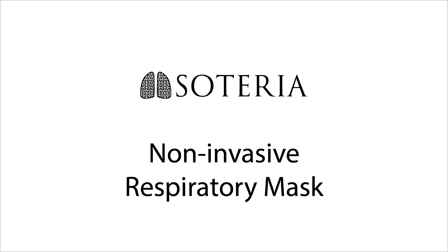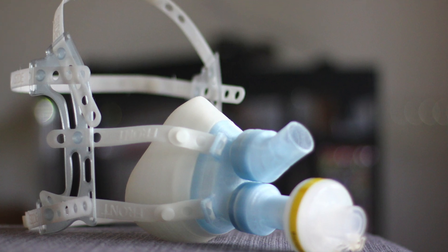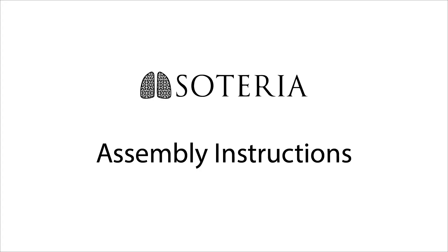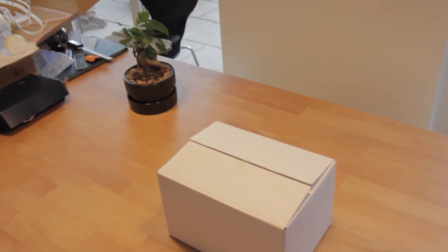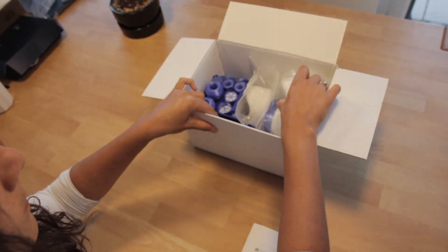Welcome! We are Soteria, a 3D printable, non-invasive respiratory face mask, and this video will show you how to assemble all the parts. For a detailed description, refer to the user instruction manual in the box.